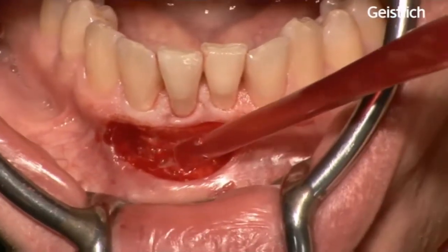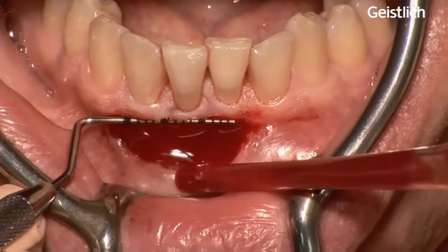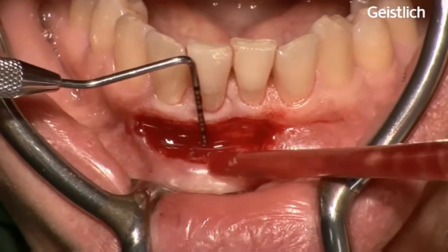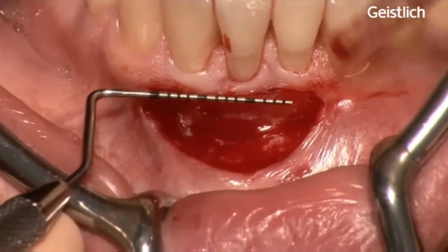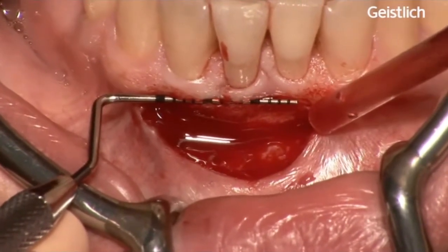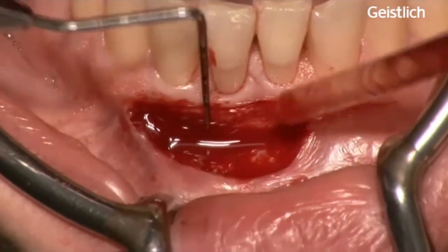After final preparation of the flap, measurements of the recipient bed are taken with a periodontal probe. In this case we need a graft matrix size of 15 mm long and 7 mm for the depth of the vestibule.